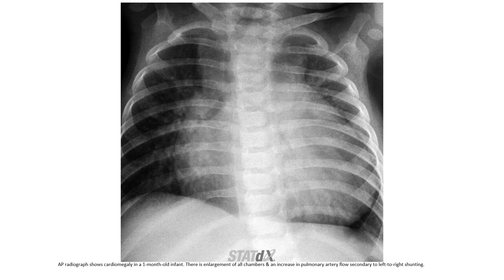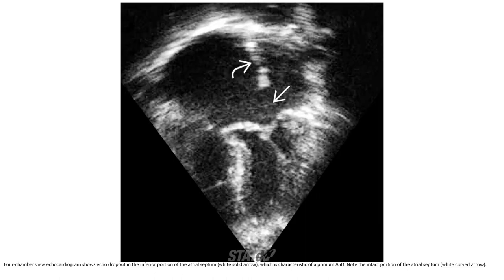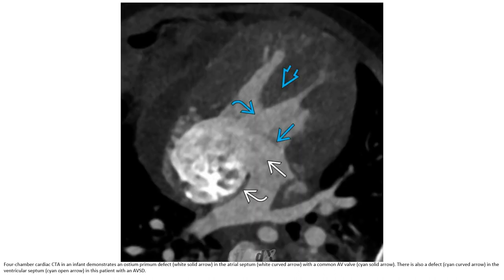The radiograph of cardiomegaly in a one-month-old infant demonstrates enlargement of all chambers and increased pulmonary artery size secondary to left-to-right shunting. On the four-chamber echocardiographic view, echo dropout in the inferior portion of the atrial septum is characteristic of an ostium primum ASD. A four-chamber echocardiogram demonstrates an ostium primum defect in the atrial septum with a common AV valve. There is also a ventricular septal defect in this patient with AVSD.